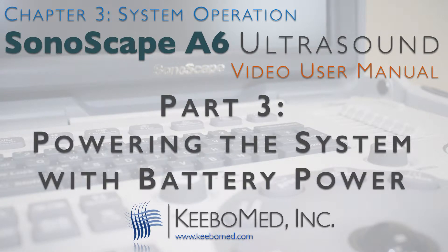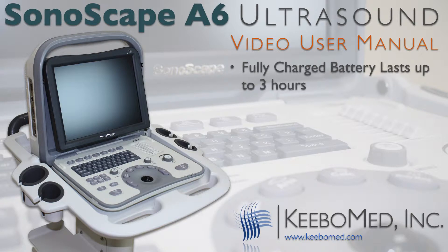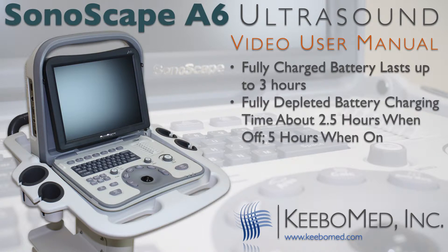The battery serves as a reliable power source when no AC power is available. A fully charged battery can provide power to the system for up to three hours. Battery charging time when the battery is fully depleted takes approximately two and a half hours when the system is off, and approximately five hours when the system is on.